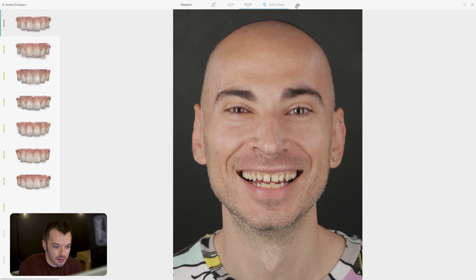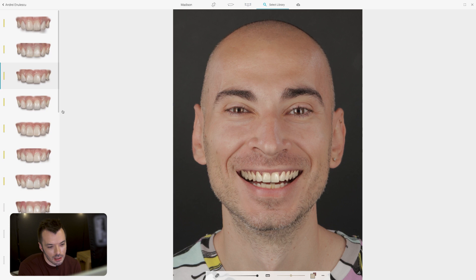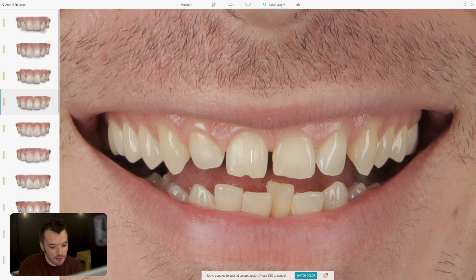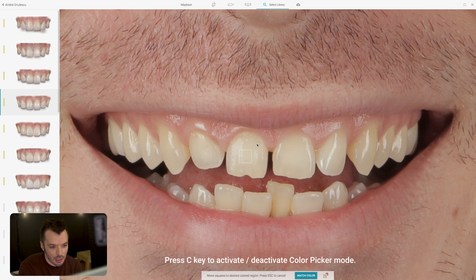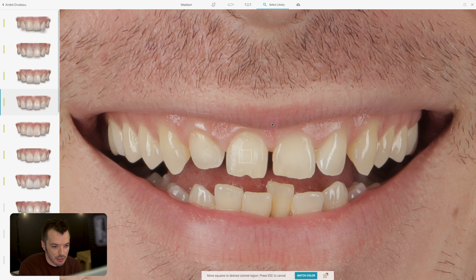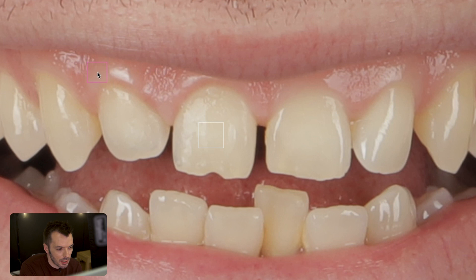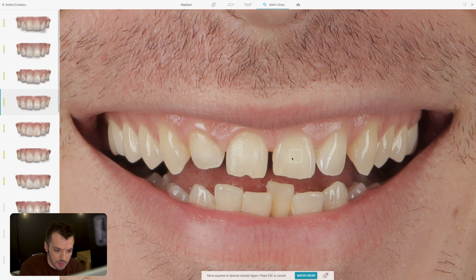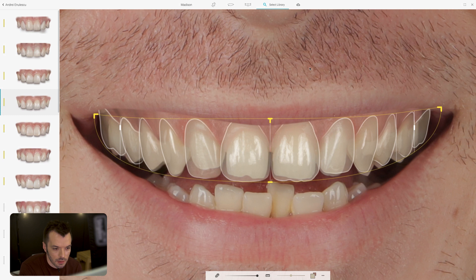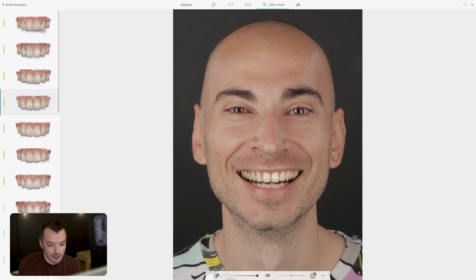After finishing this, I click Search, which works like a search engine and renders the libraries. You can see the gingiva color in the rendering is too dark, so you click the color picker, select an area, and the system takes the color from there. Be careful not to pick a reflection area — pick a nice area of the gingiva with a good color, then click Match Color and the colors will match very nicely.